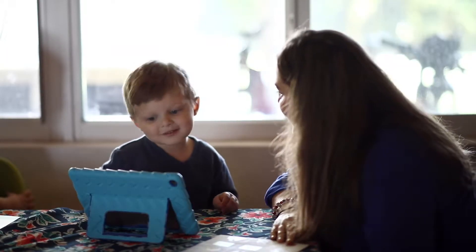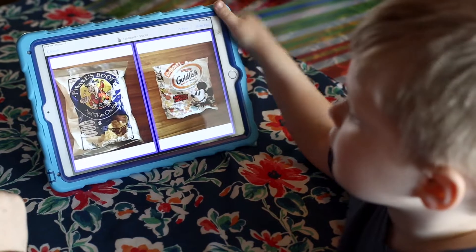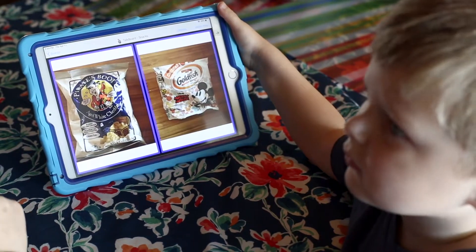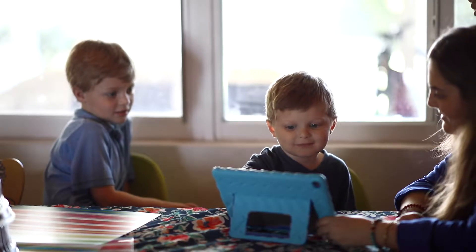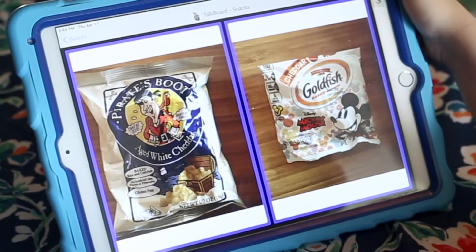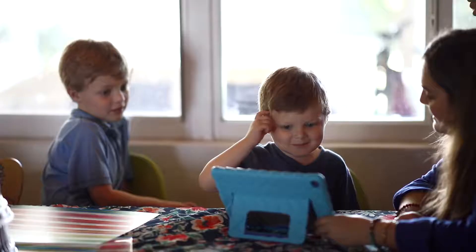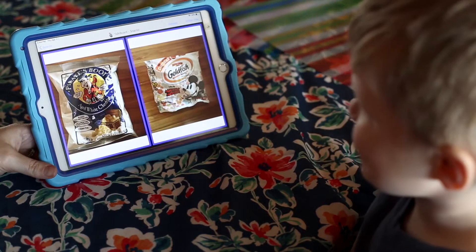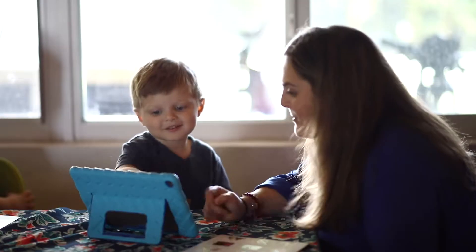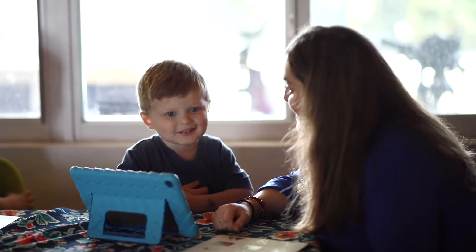Dylan uses a simple two-option communication board. To teach Dylan how to use his communication board to comment, Dylan's mom gives him several snack options. Then she lets Dylan pick his response, offering some wait time so Dylan can process and think about the communication interaction he just witnessed and ultimately choose his intentional response.